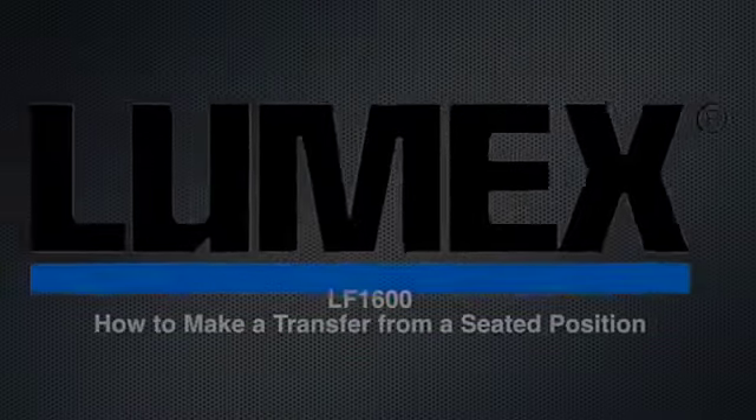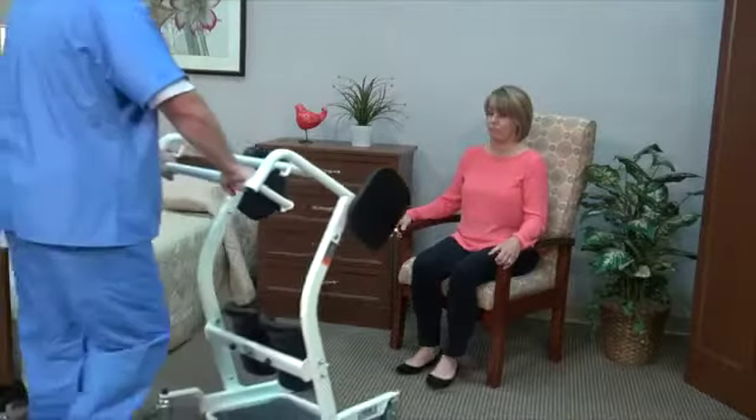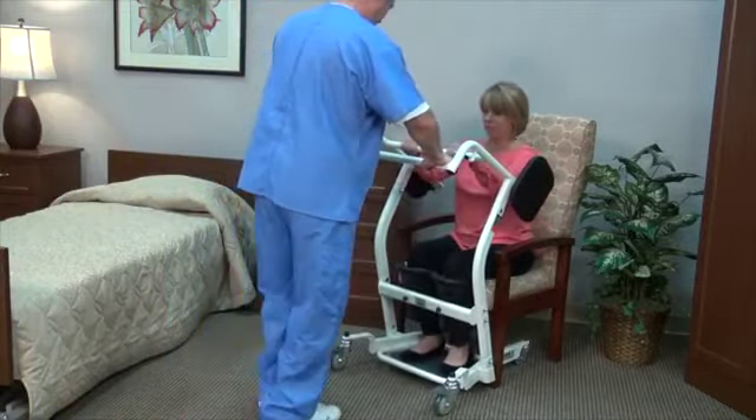Lumex LF 1600 — how to make a transfer from a seated position. This is a manual sit-to-stand lift. Position the lift in front of the resident and lock the casters.